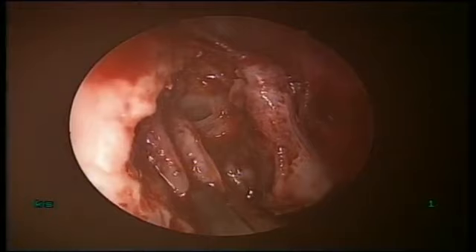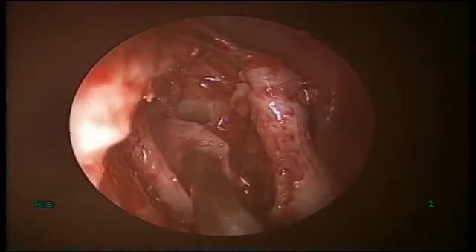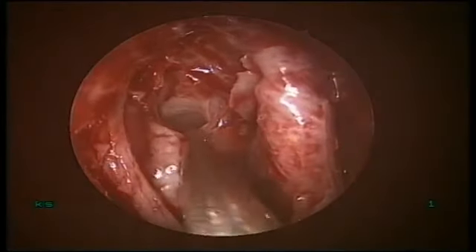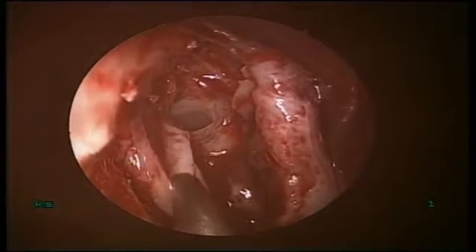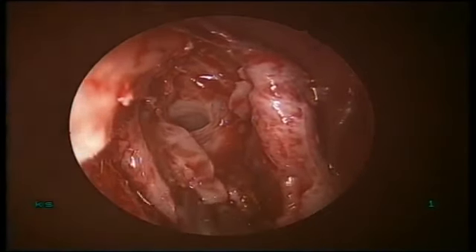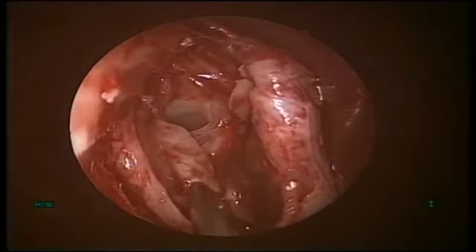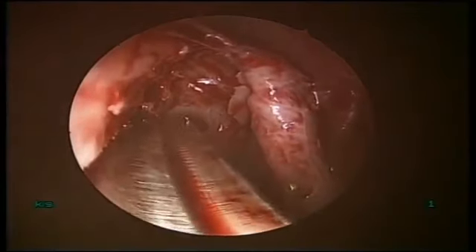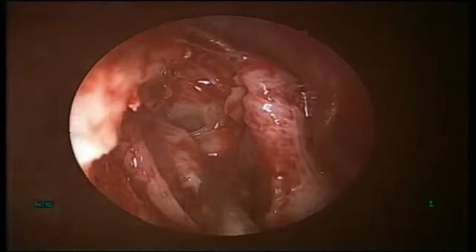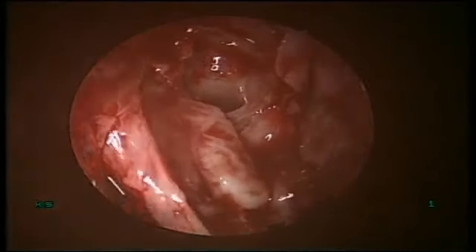Okay, and you can marsupialize it behind. See behind what I have done. I have made the surface raw to take this flap and allow it to adhere there. Okay, see this, without any tension this flap is going to lie down so easily. See that? That's the interior of the sac.